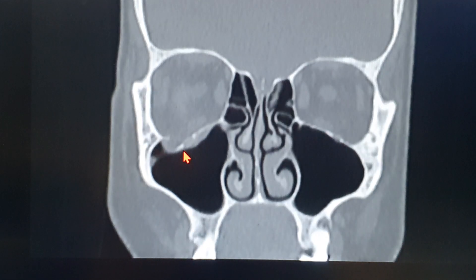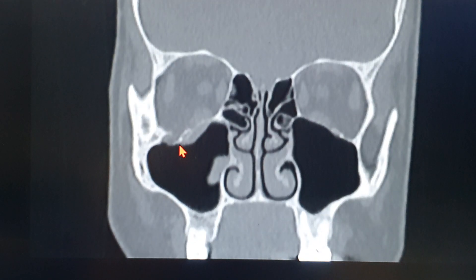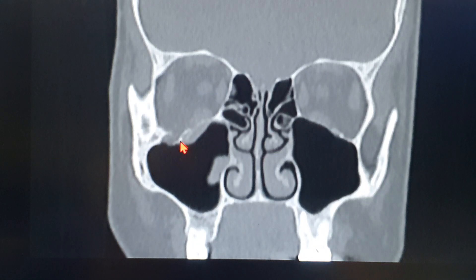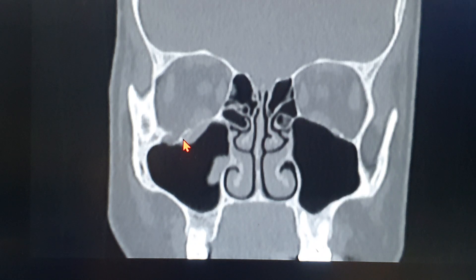As I keep going back, you can see the canal of the nerve is lying within this fracture segment. This appears to be the infraorbital nerve canal — correct me if I'm wrong, but that's what the CT scan is showing. So this is the infraorbital canal — not the foramen, but the canal — basically along with the nerve. The patient came for a second follow-up to my clinic.